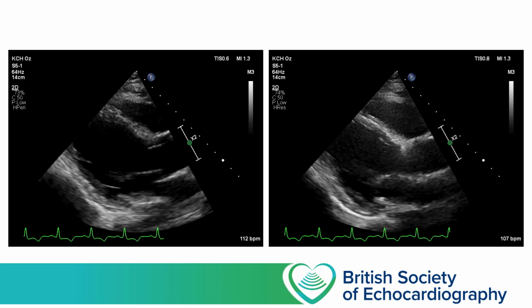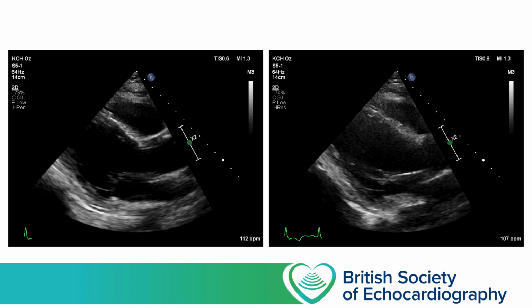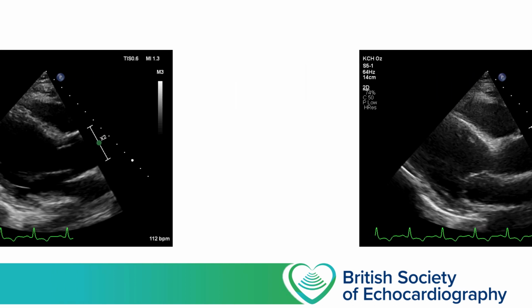Once again, neither of these decisions is right or wrong, and if you can adjust the frequency of a transmitted wave, then your decision to do so will be influenced by what it is you're trying to demonstrate.